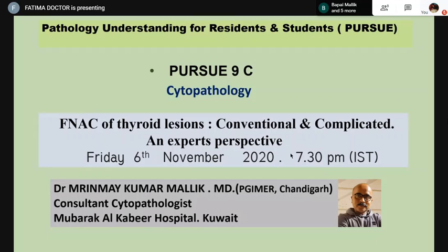He will try to teach us how to approach thyroid FNA and how to go about it, what are the Bethesda criteria, and how each and every aspect has to be looked in. So this is a very good talk for everybody to understand thyroid FNAC and various aspects of thyroid cytopathology.